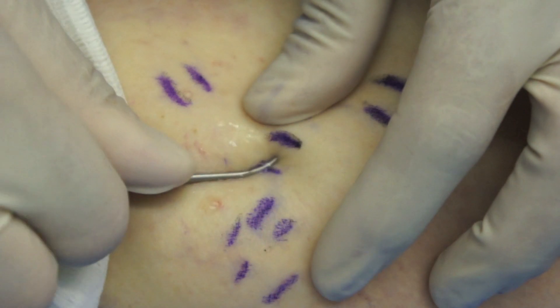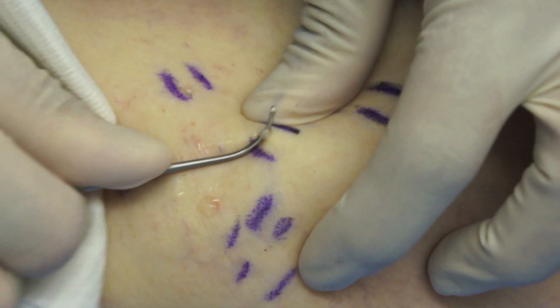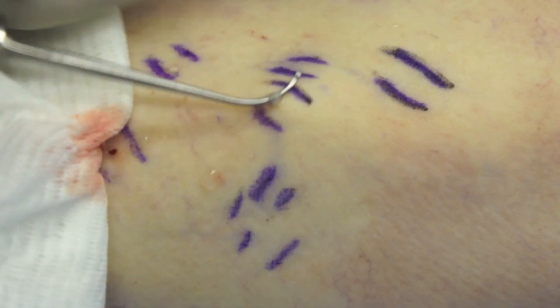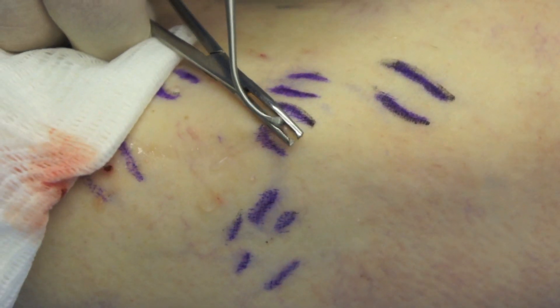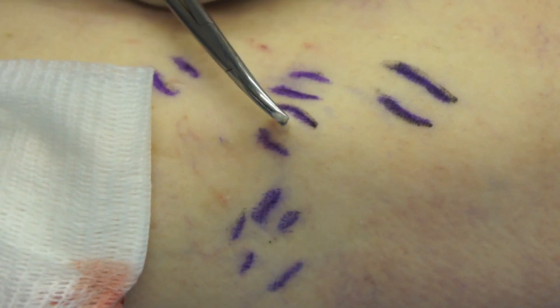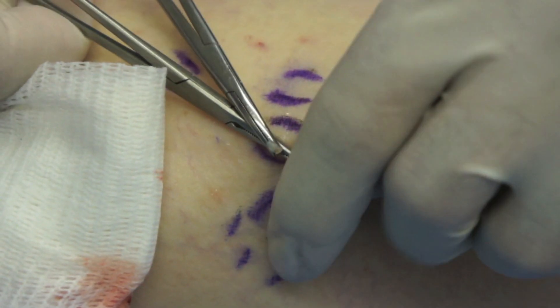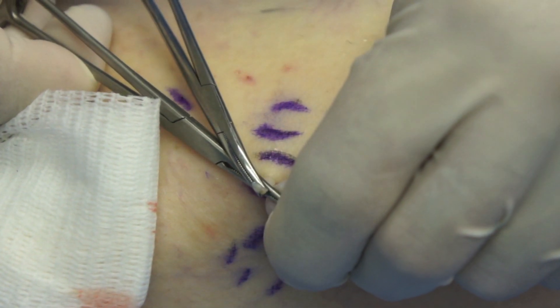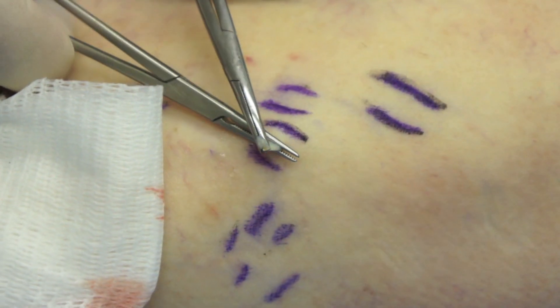The vein is then extracted using a vein hook. My own preference is the Ursh instrument, but other hooks work very well. Gentle traction allows delivery of the vein, and by serial adjustments of the clips, a long length of vein can be extracted. I like to use my thumb on the tip of the clip to produce an even traction on the vein.